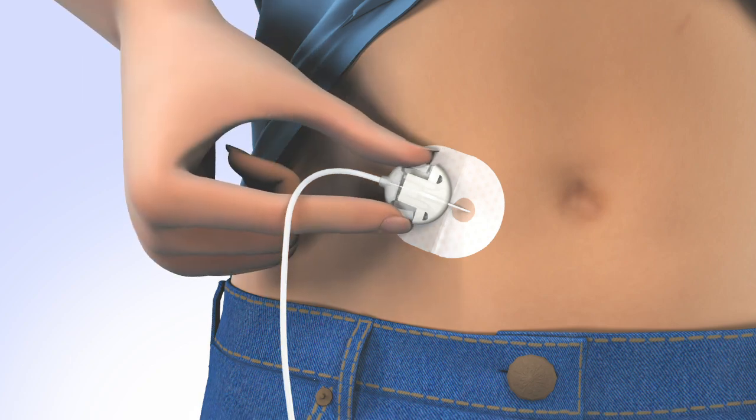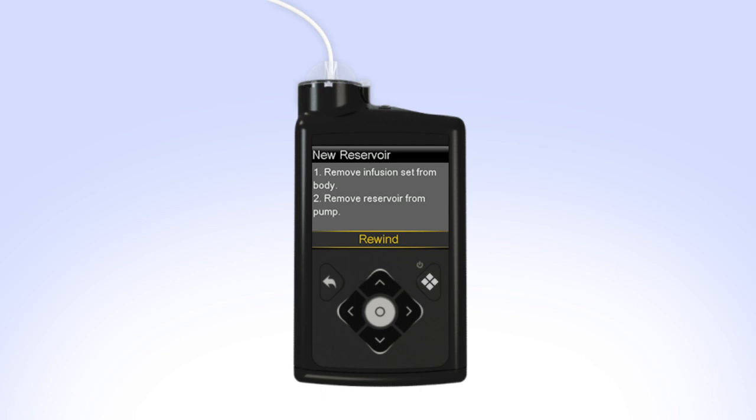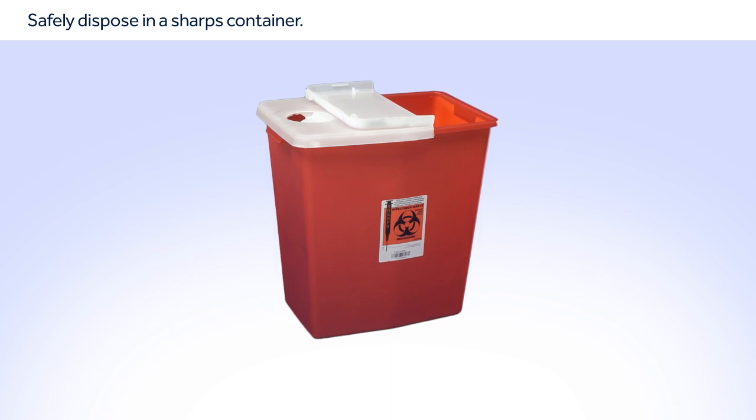Remove the infusion set you are currently wearing from your body. Then remove the reservoir from your pump by turning the tubing connector counterclockwise. Safely dispose of the used infusion set and reservoir.